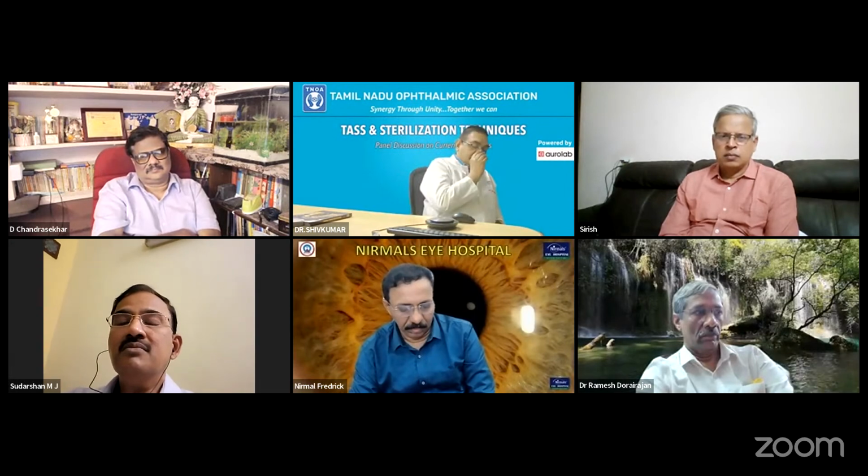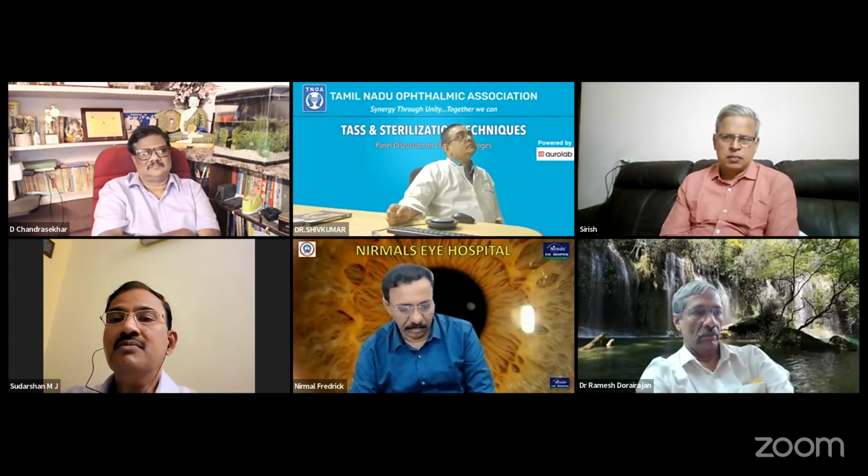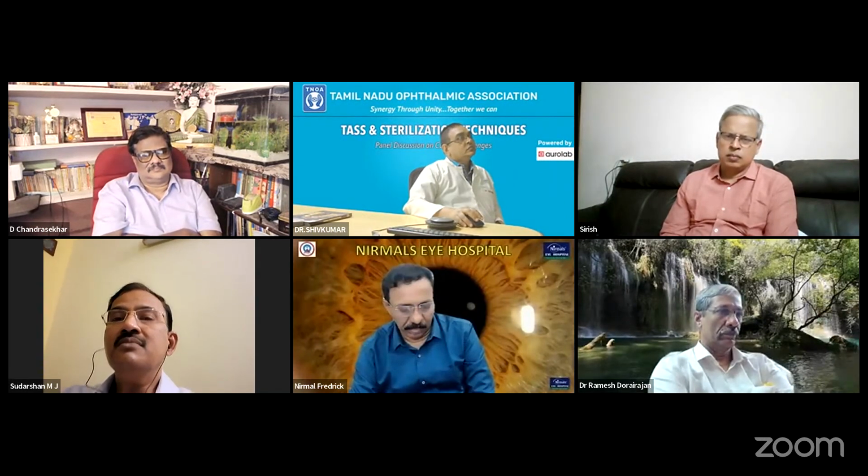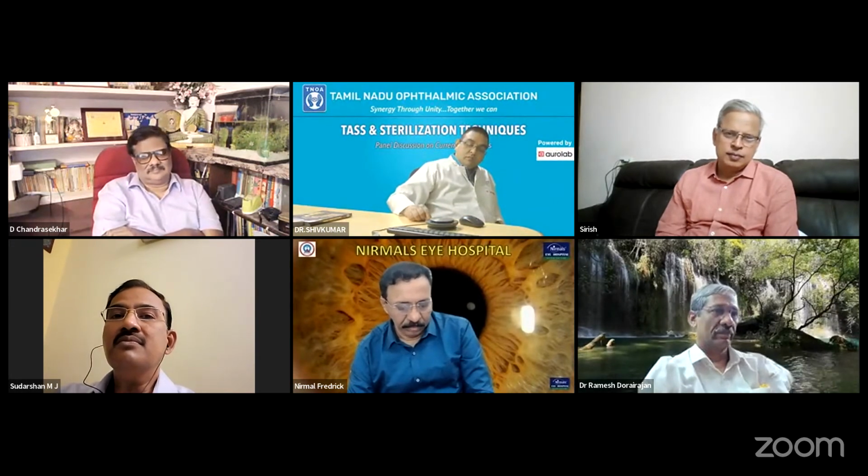At the end, if it is rinsed with better quality water, having a lower bacterial load, that will also help the hospital to get rid of hospital-sterilized items releasing endotoxin. These are the various things I have been observing, sir. I'm not sure whether I've answered all your queries, but this is what I have.